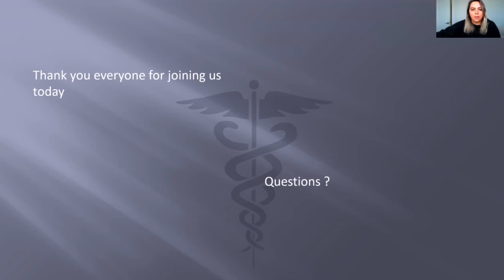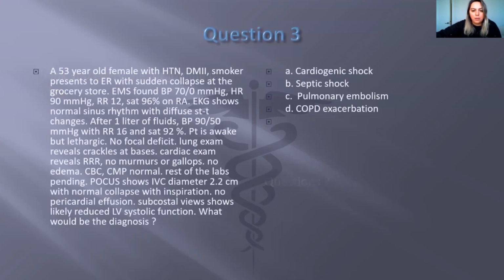Thank you. Next question is, actually, I see some questions about case number 3, so we may have to go back. In a patient with cardiogenic shock with reduced EF, how would BP be affected by IV fluids as we push the patient further to the right of the Frank-Starling curve?